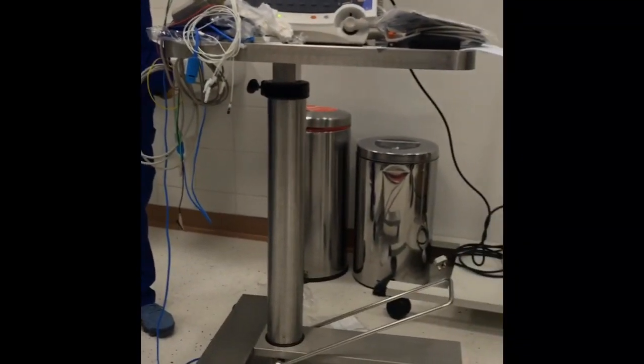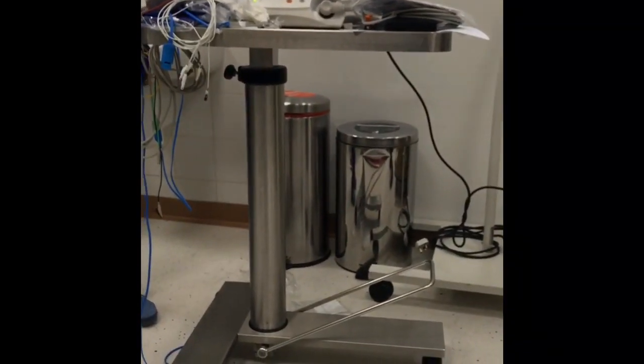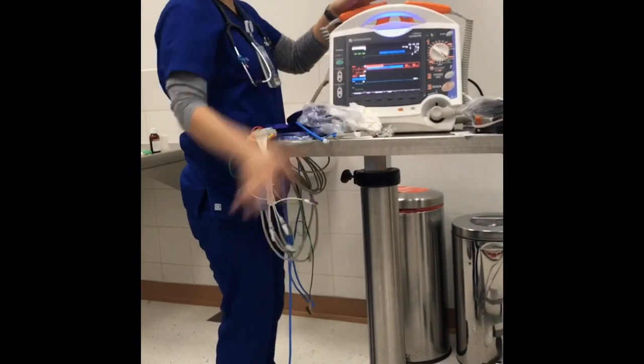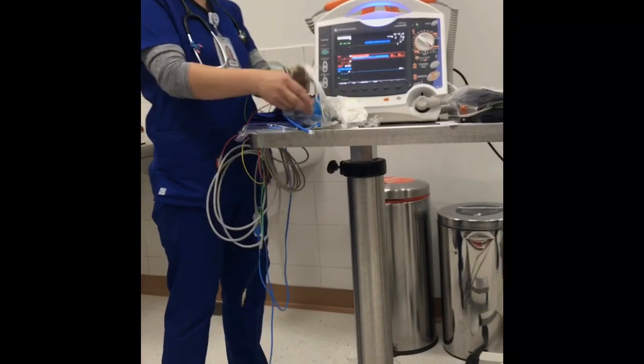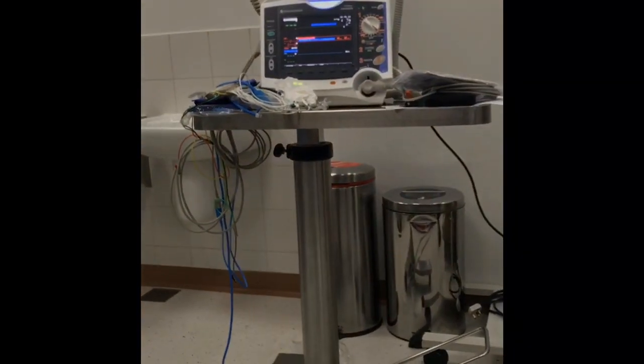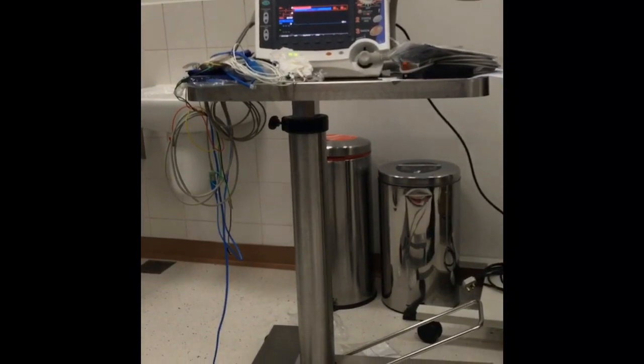So let's go to the basic check. How to do the basic check? Basic check is very important per shift, because this is an ambulance. You don't know, traveling from one place to another place, so you have to do the basic check properly.